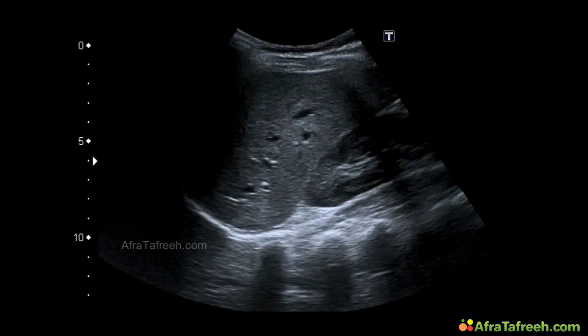Yes. So here another organ comes into our view. The right kidney over here, and liver parenchyma. So we have got the inferior part of the right liver lobe. So we know we are on the right side of the patient. That shows us that neighboring organs can help us in our orientation. Do you already remember the segments of the right liver lobe on the caudal side? Segment 5 and 6. So segment 6 is near the kidney.